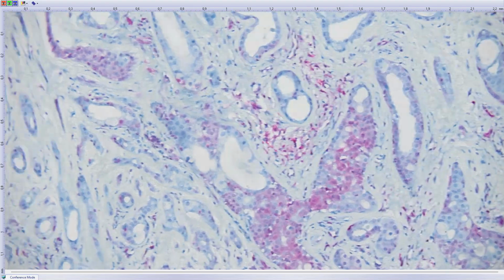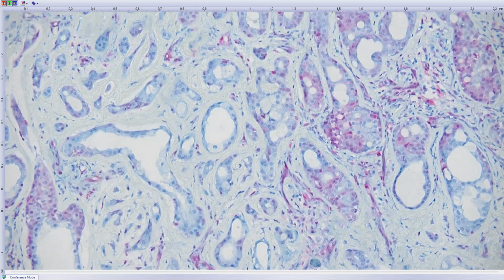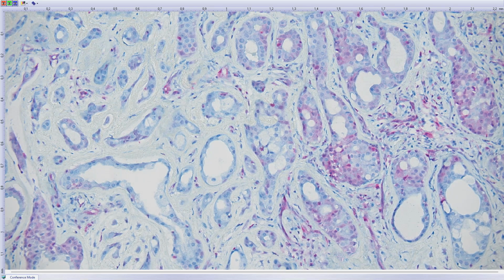Be it as it may be, I'm not sure that it is mammary analogue secretory carcinoma, but it's typical of it, and it looks always like that, so it would be nice to define them more, so that we are looking for more cases. We have sometimes cases with these proliferations. Probably will employ more FISH because some cases are very old. Yeah?